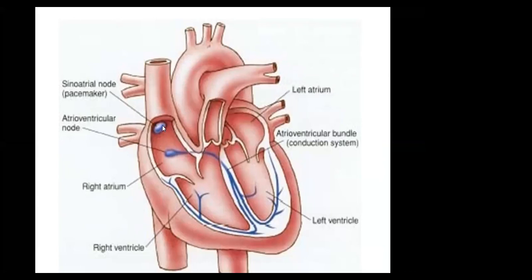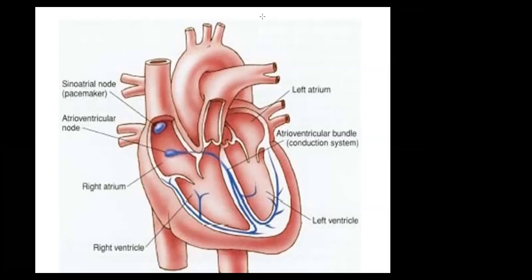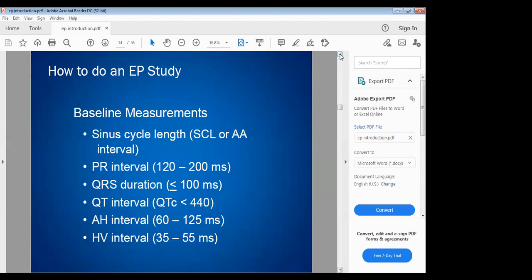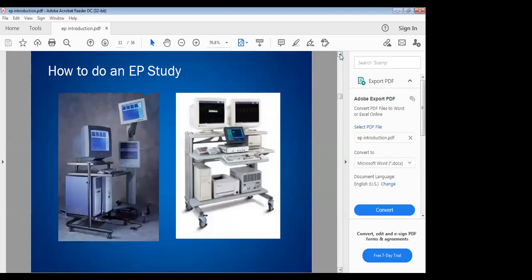But I want you to get something fast. As I said, the catheter can be in the atrium. I can pace from the atrium, and it will generate electrical activity down the ventricle. So I'll show you what I mean in the next slide now. Sorry, my slide is changing, right? Yes, it is. Okay, great.